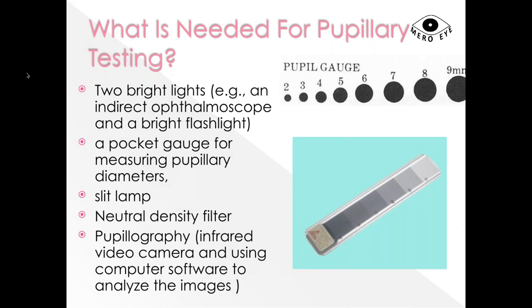Then the newest method, pupillography, which is a technique to measure the pupillary action using an infrared video camera, which uses computer software to analyze the image. This pupillography is recently gaining a lot of importance, especially for refractive surgery purposes, where we measure the mesopic pupil size.